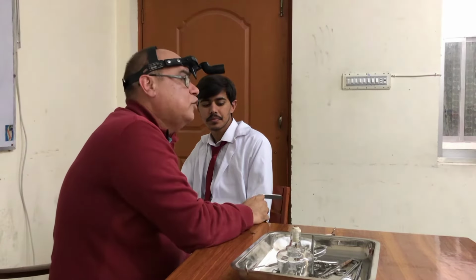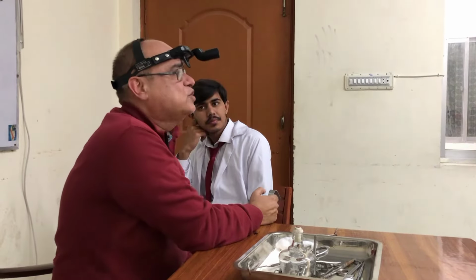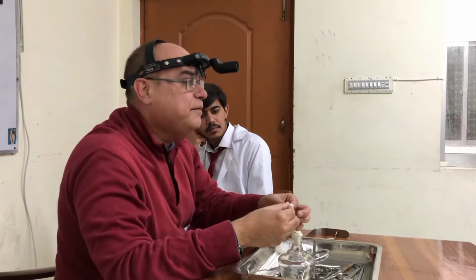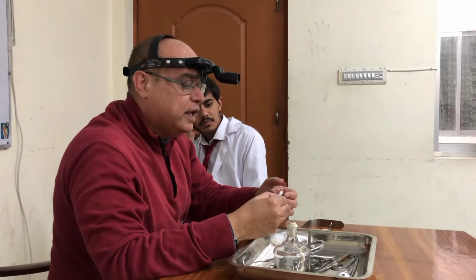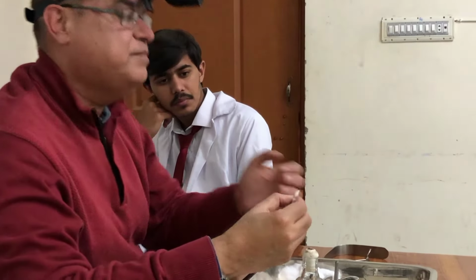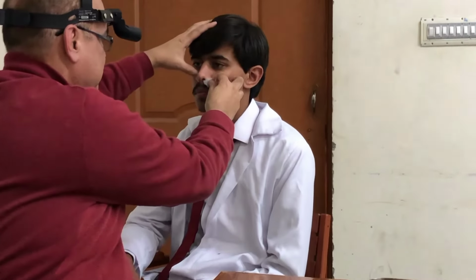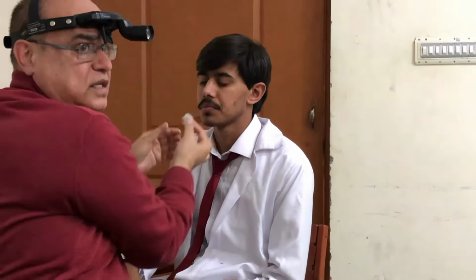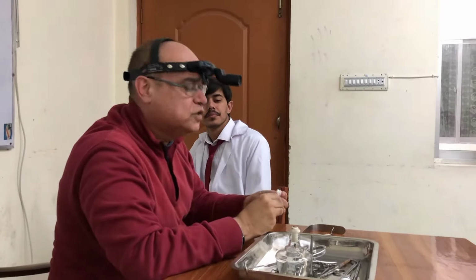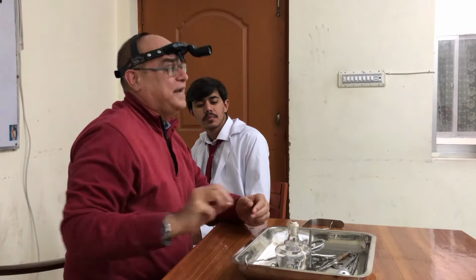Okay, but during summer season there will not be fogging at all, because here the temperature is so high. At that time what we can do is take a wisp of very thin cotton, and ask the patient to close one side, and you can see the movement of this cotton wisp. So you can see the movement, so that clinically you have checked that the airway is patent.